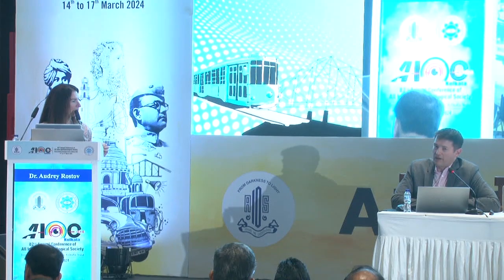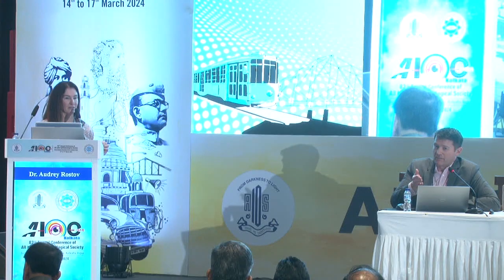So it's actually pigment impregnation on the surface of the optic. Correct. Because you mentioned avoid it during the YAG, but then you mentioned also avoid touching it during the implantation. Yes. It'll come off. So you need to avoid it, as Jode said, both during the YAG as well as be careful of it. Don't touch your instruments to it during implantation or during your IA.